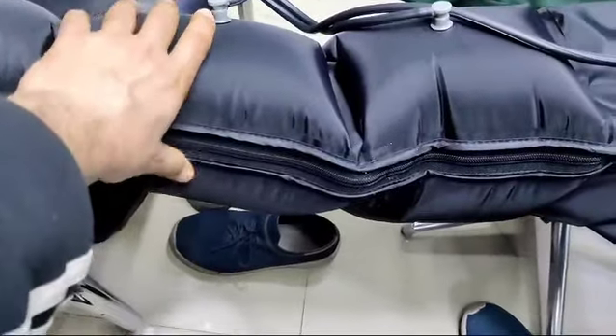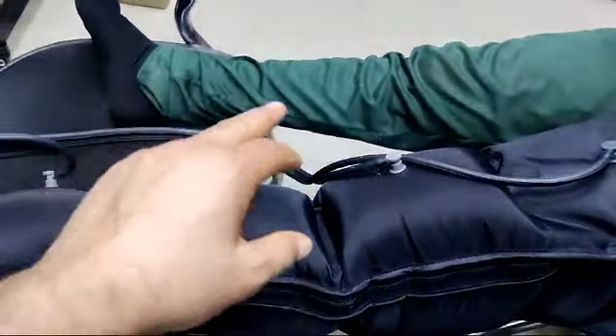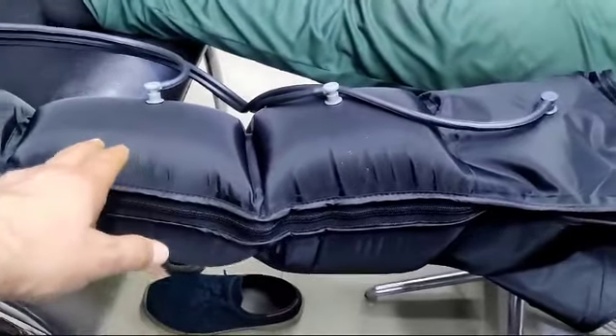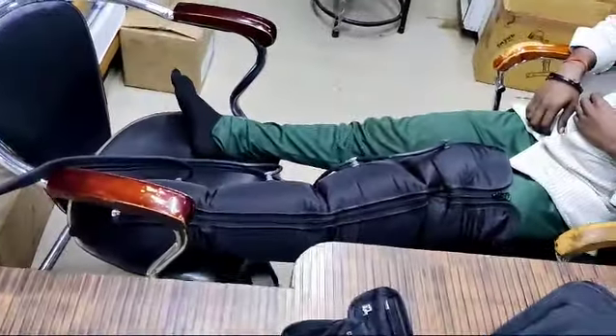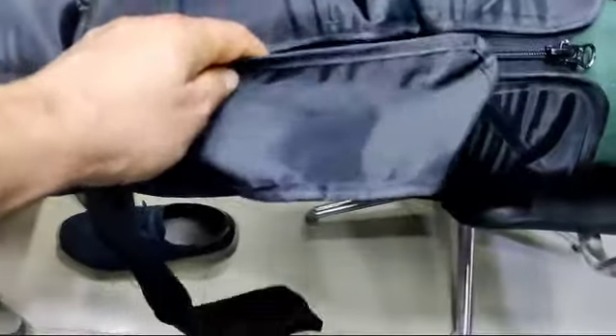You can see the hardness and quality of the material. There are two leg attachments — I am just using one here. You can use it on the other leg too. There are two leg attachments, one waist attachment, and one arm attachment — usable on legs or arms. These are the leg extensions: if the patient's leg is bigger, you can add this extension using the sliding chain to suit larger legs.